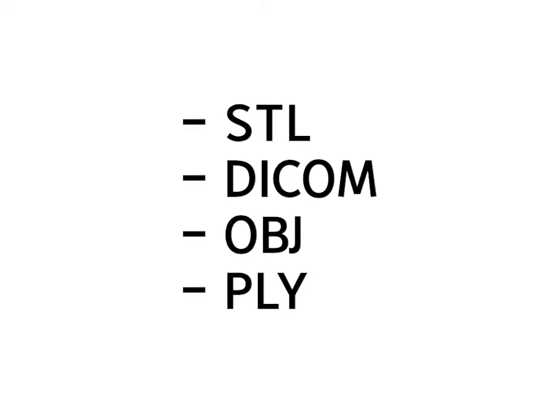Another limitation of this kind of file is that it does not include any metadata or personal information about the patients. For this reason, although this could be beneficial from a legal standpoint, there is a tendency toward replacing STL files with files that store patient data, such as DICOM files.